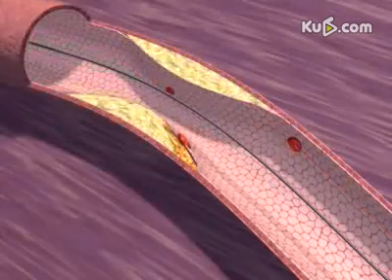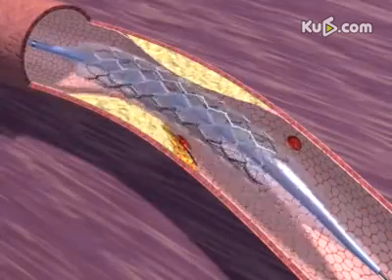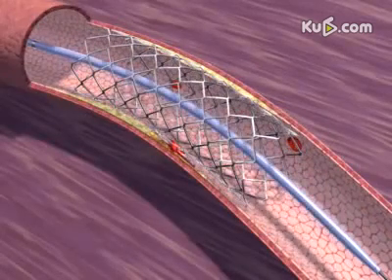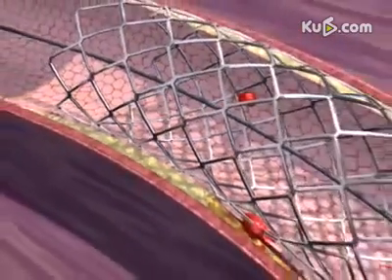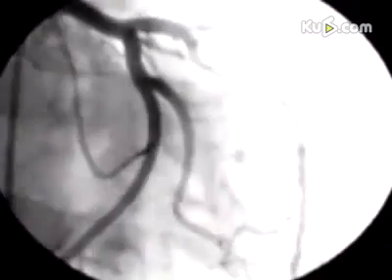This reveals a short, moderately stenotic plaque, which is treated with a single stent without the need for predilatation. There is minimal, if any, residual thrombus present at the stent site. Angiography following thrombectomy and stenting shows an excellent result.